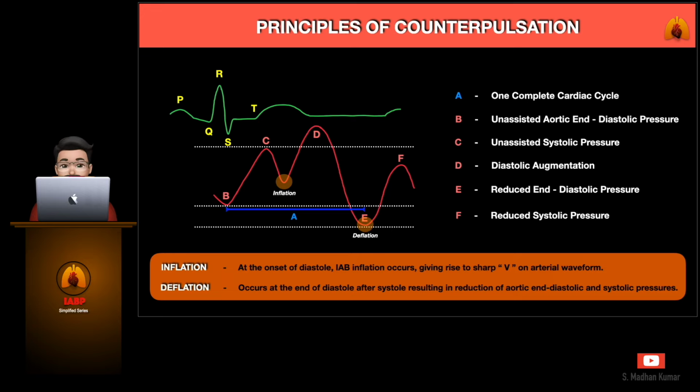Trigger is the physiologic signal from the patient that identifies the new cardiac cycle, and ECG is the preferred source since the electrical precedes and initiates the mechanical event. The R wave on the ECG represents the onset of the new cardiac cycle and is referred to as the trigger event. In circumstances where the ECG is not available for use as the trigger, the arterial blood pressure may be used to synchronize the patient's cardiac cycle.